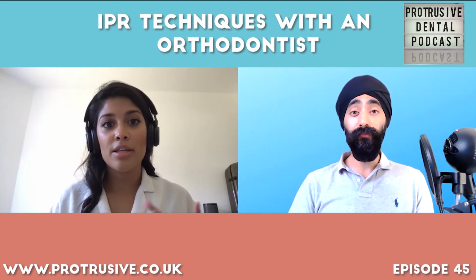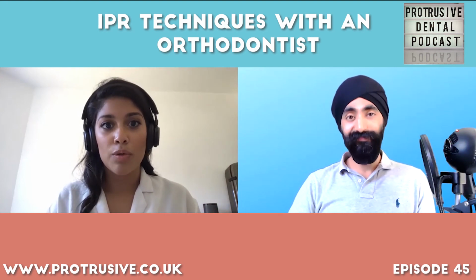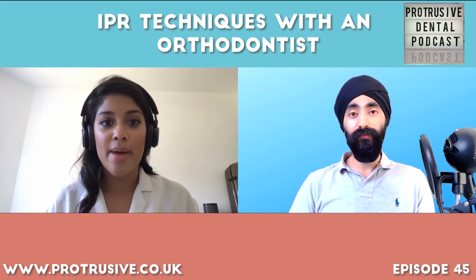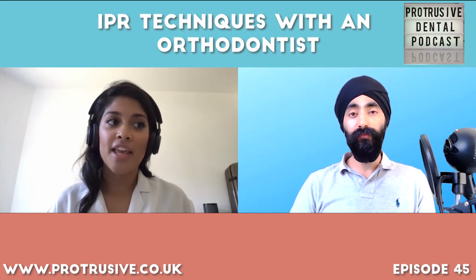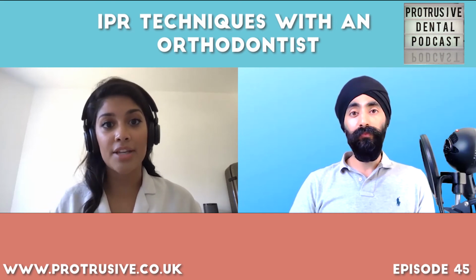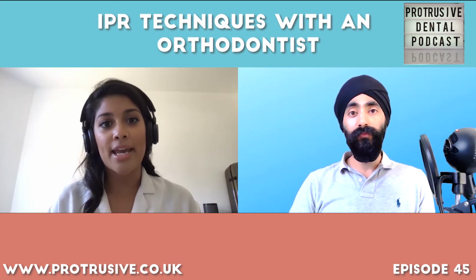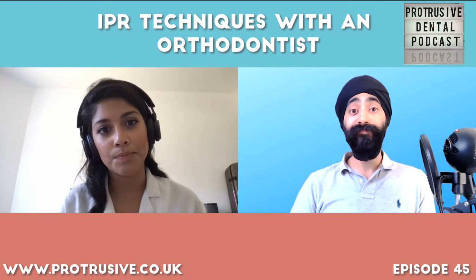And then when you're planning, don't just follow what the ClinCheck's telling you. Although Invisalign plow billions of pounds into their system, and it's a really great system. I love Invisalign, but it is about the clinician planning the case. And that's one thing I think is really important. So think it through. You can tell Invisalign, I want IPR at this stage. And that will make you an even better clinician if you put your take on it, because you are the person planning the treatment. Invisalign is just a tool.